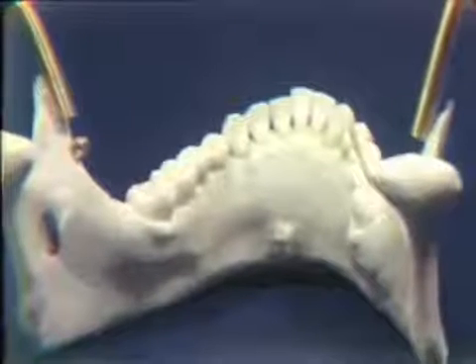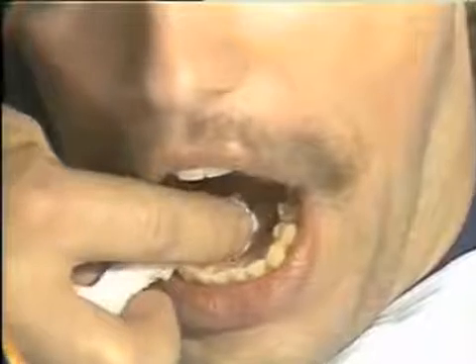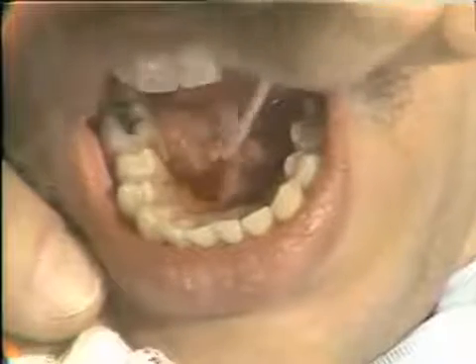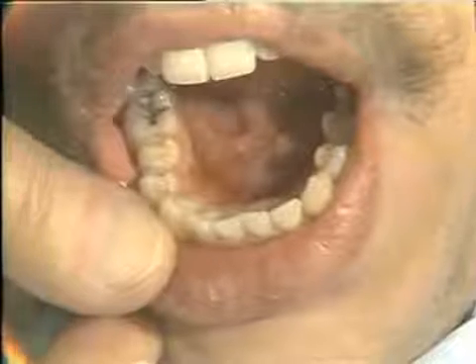Let's try it on the patient. All right, let's show it on the patient. Andy, if you'll open real wide for me, please. We'll dry our mucosa again in the usual fashion, and then we'll apply a little betadine to our injection site right in the floor of the mouth where those tissues reflect onto the alveolar ridge, just lingual to the cuspid.